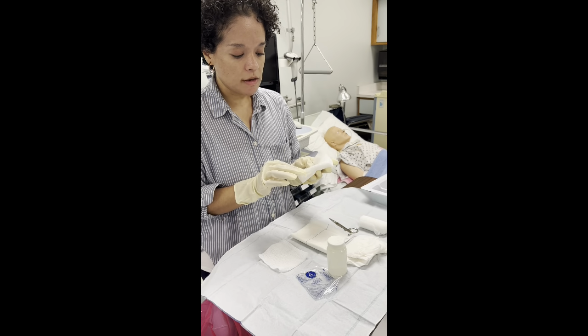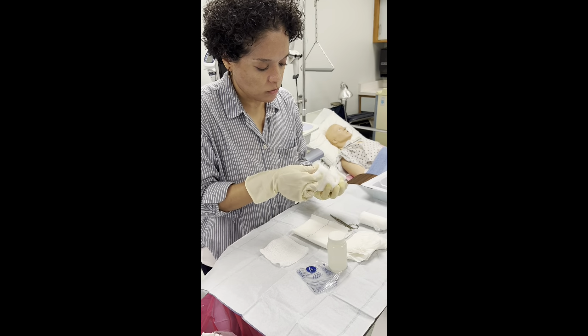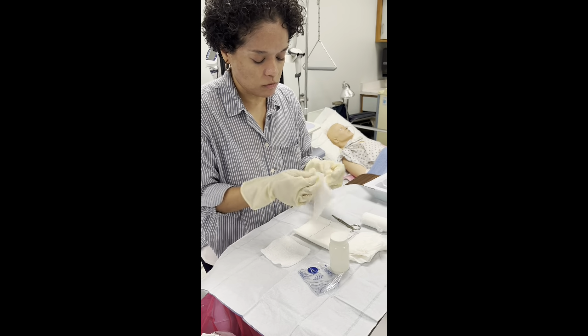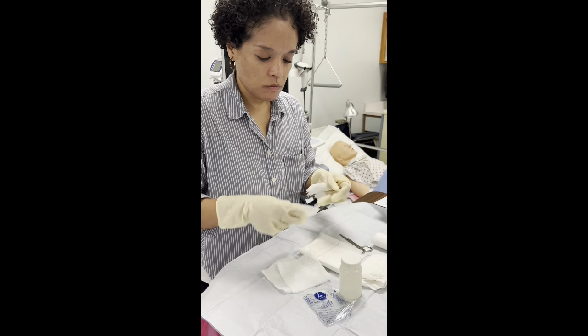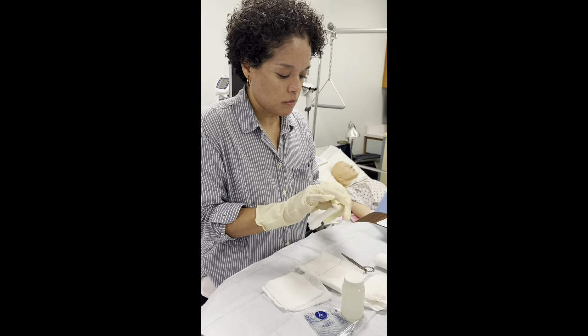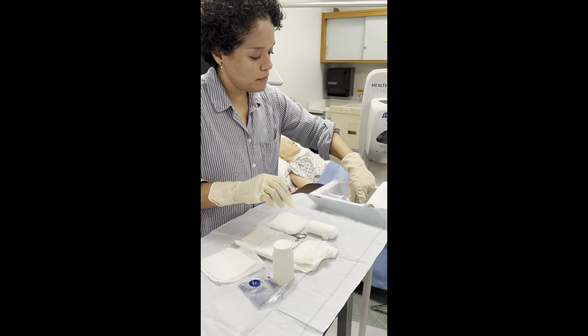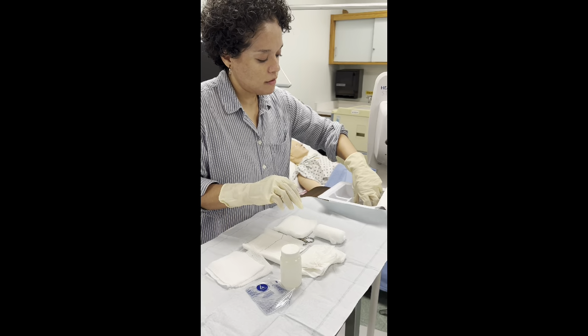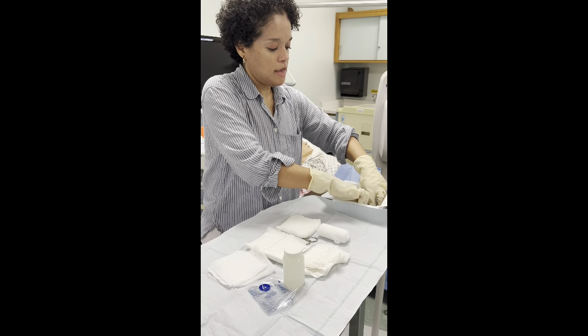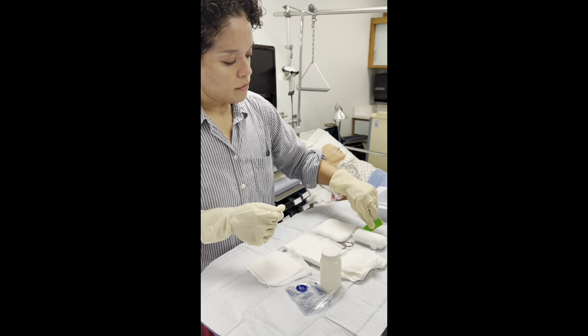So I have one here. Two and 3. And then you have a label, which you would place at the end of applying your new dressing.